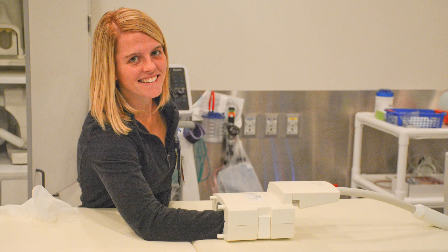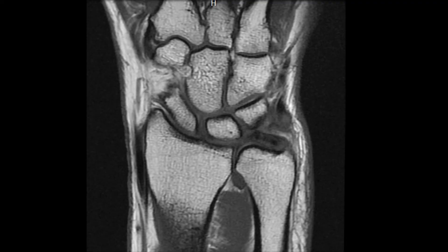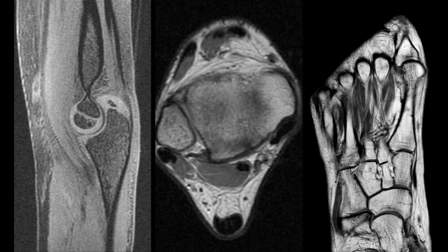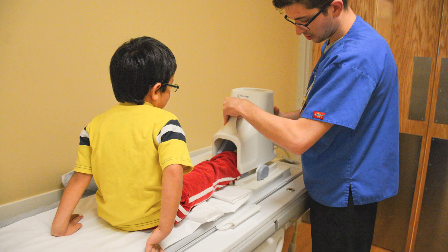A specialized wrist coil designed to fit an average adolescent or adult wrist is necessary to provide high-quality images of the wrist, but can be used in smaller children or infants to image an elbow, ankle, foot, or hand. These coils are very sensitive and are critical for creation of high-quality images.